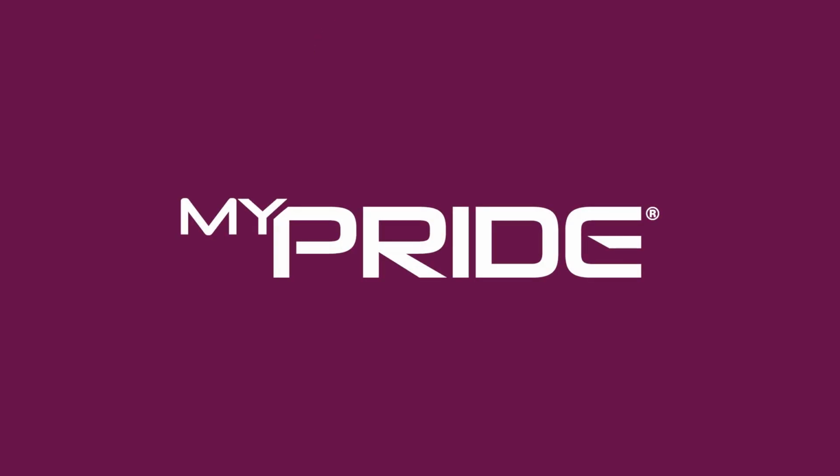With the My Pride app, you'll be armed with product information, access to local dealers, and helpful tips to maximize your mobility experience.